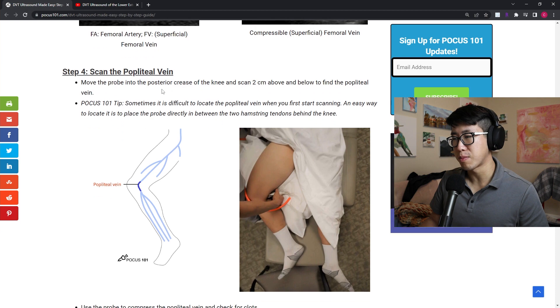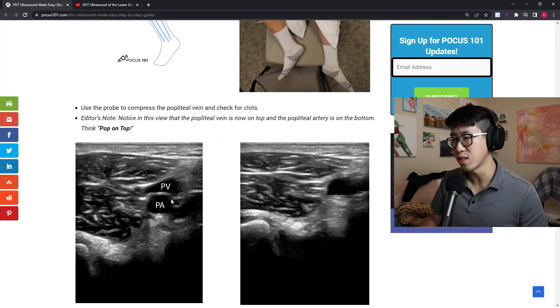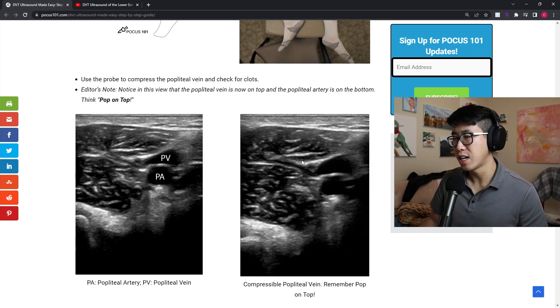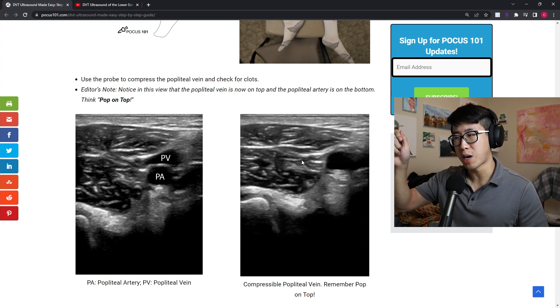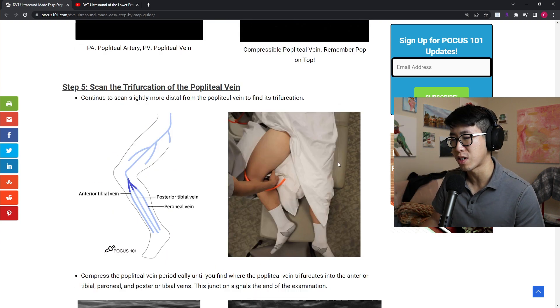The next landmark is the popliteal vein, right behind the knee. You're going to look for compressibility above the popliteal artery. What they want you to remember is 'pop on top' — the popliteal vein is on top of the popliteal artery. You'll scan one to two centimeters above the popliteal vein and then down, which gives you a good area to test compressibility and see if any clots are present.